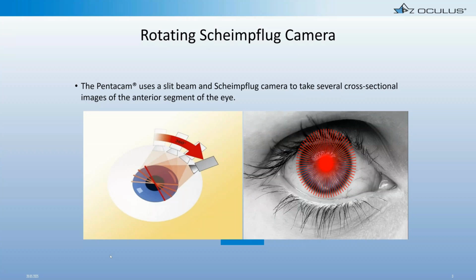And as we talk tonight about Ortho-K lenses, that is part of our plan, to make our lenses nearly full corneal. If we want our lenses to be accurately fit, if we want first fit success, if we want to be able to fit complex corneas effectively and efficiently, we need full corneal data. We need it to be accurate. And Pentacam gives that to us.